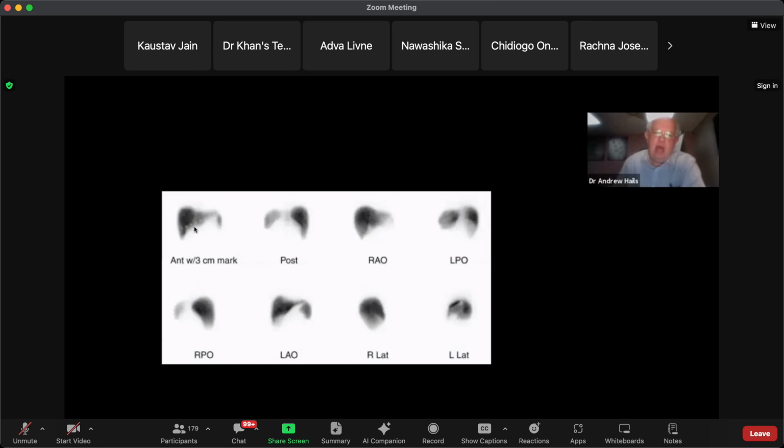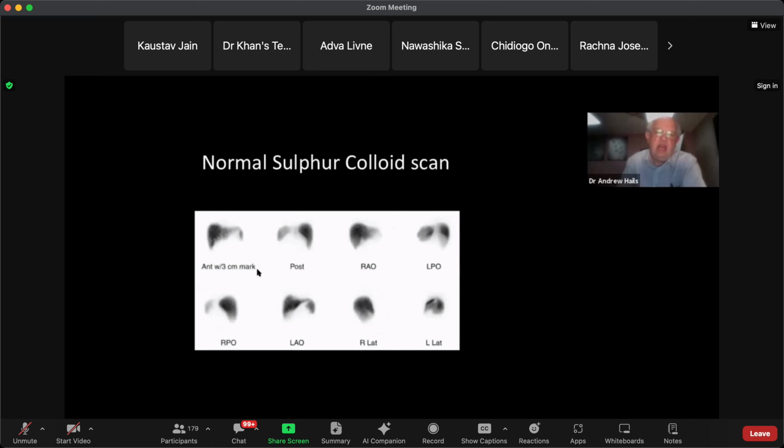And you can see here people have put little lucencies, maybe little radiopaque markers along the side of the patient's ribs to show where the bottom of the liver was. So to give you some idea of the size. This had its heyday years ago before CT was widespread. And it was a way of looking for focal defects in the liver.